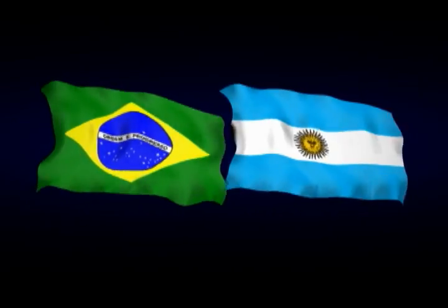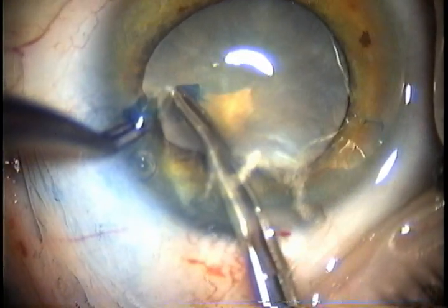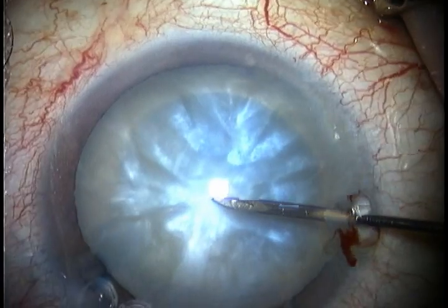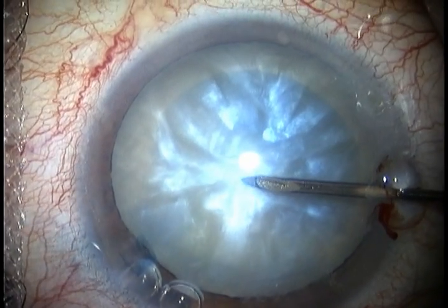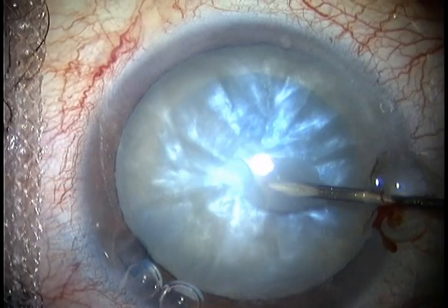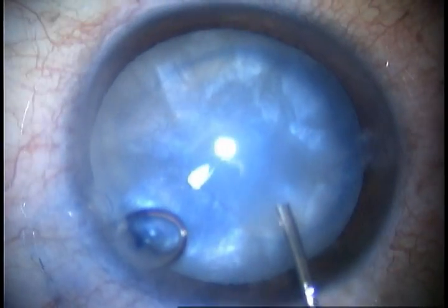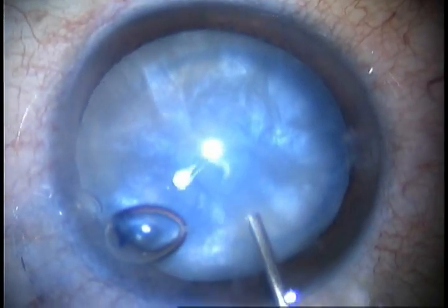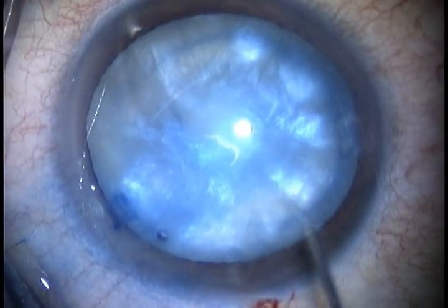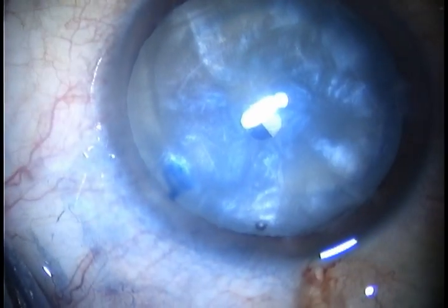So let's turn to the Brazilian solution for the Argentine flag. There are two main difficulties for the prevention of the sign. One of them is to turn the anterior capsulotomy to a continuous one, and we have to follow certain rules to accomplish that. Rule number one is to always have the anterior chamber pressurized at the moment of the anterior capsule puncture. Rule number two is related to the aspiration of the liquid cortex. This can be done with BSS, but we must always avoid surge of the anterior chamber. The ideal is to do the cleanup with the dispersive viscoelastic substance in order to avoid anterior depressurization.